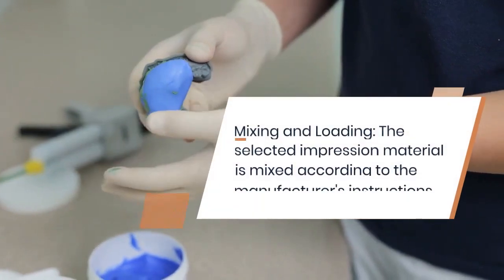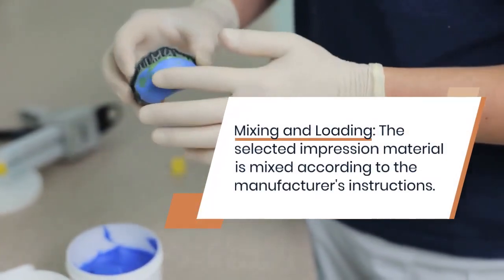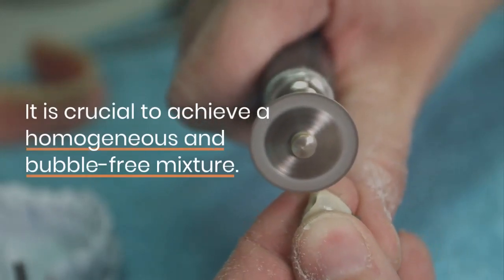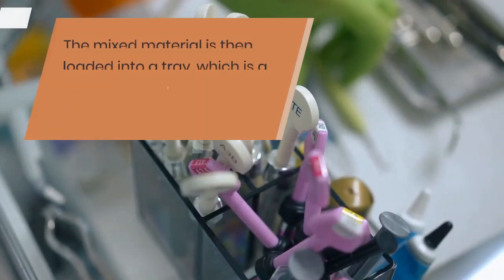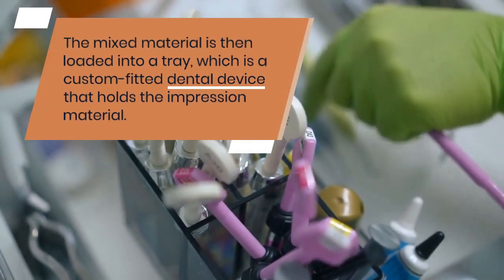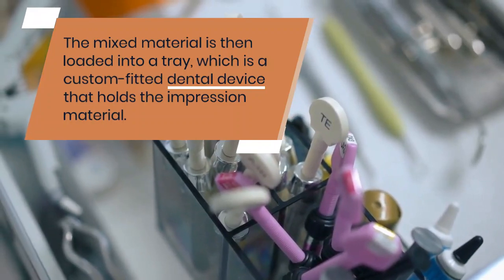Mixing and loading. The selected impression material is mixed according to the manufacturer's instructions. It is crucial to achieve a homogeneous and bubble-free mixture. The mixed material is then loaded into a tray, which is a custom-fitted dental device that holds the impression material.